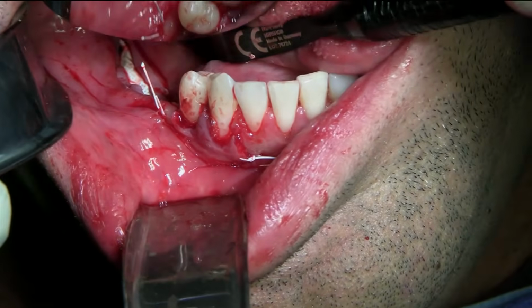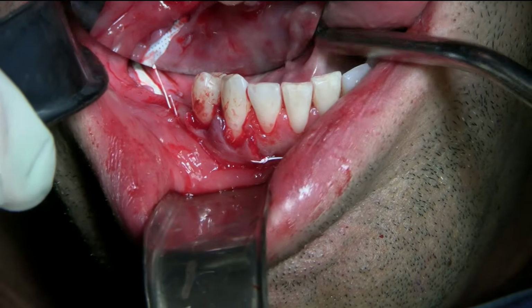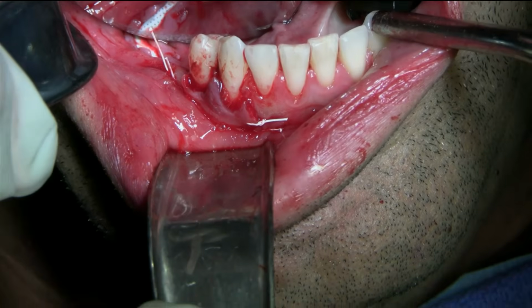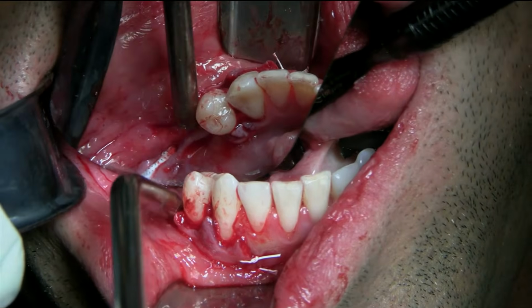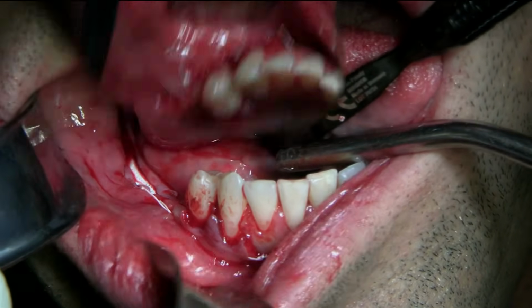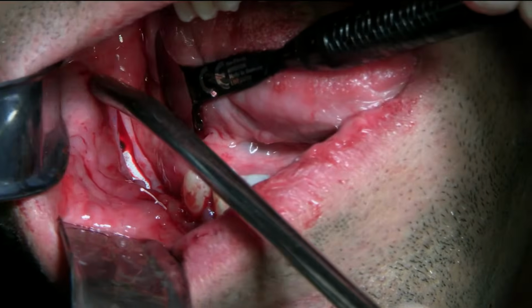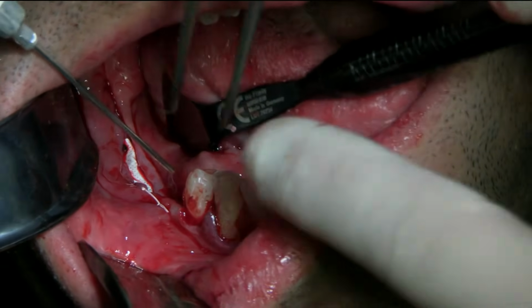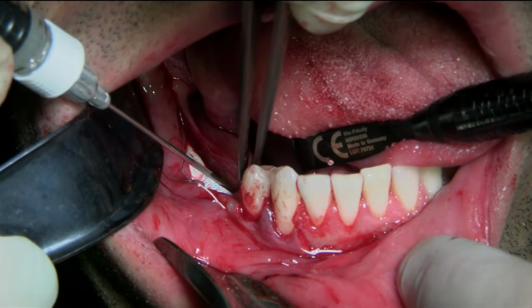Let's show the mirror. Mirror. Good, that looks like it's nicely everted. So we'll continue doing this. So we'll probably place like a good 4 mattress sutures. And I can inject a little bit of the Emdogain already here, just underneath the flap.